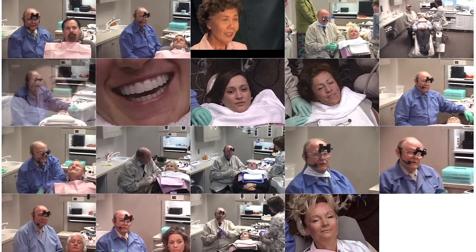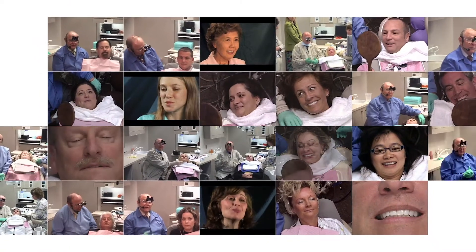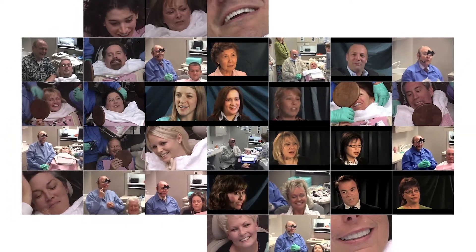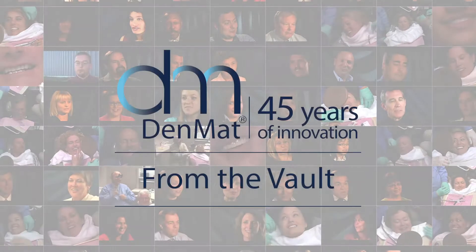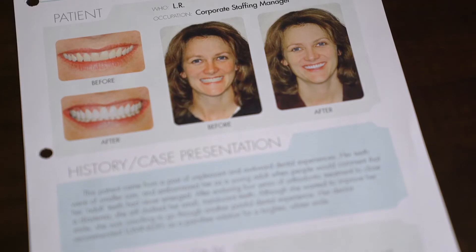Now we're going to place 10 lumineers today on our patient. And now we're not treating teeth anymore. We're treating smiles. Isn't that beautiful? Let's look at the transformation from where we started and where we are. Our patient today is an example of that.